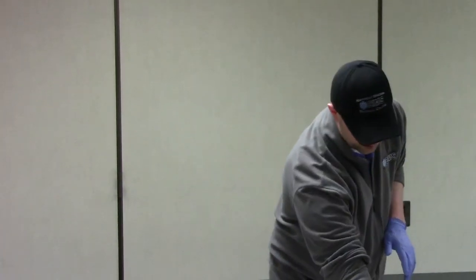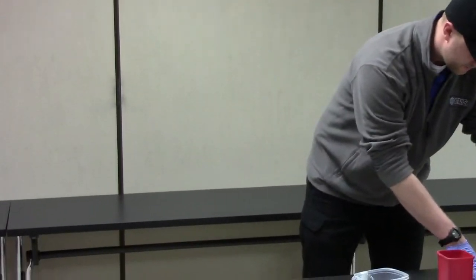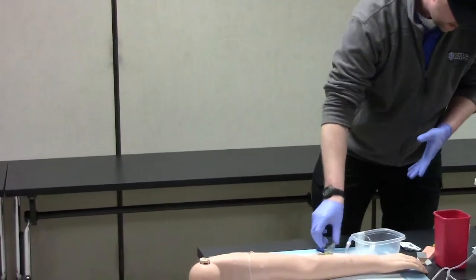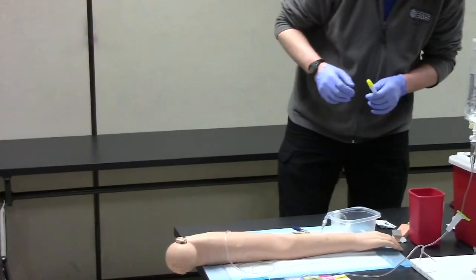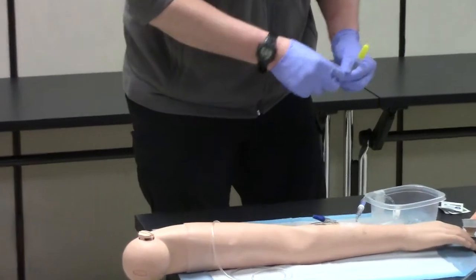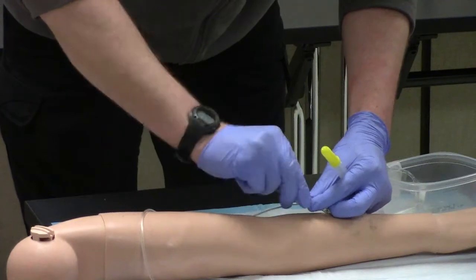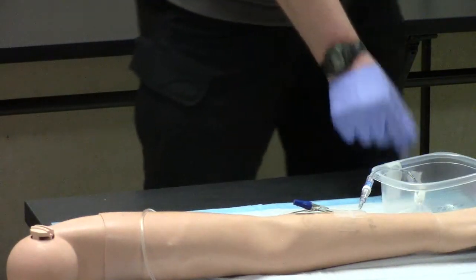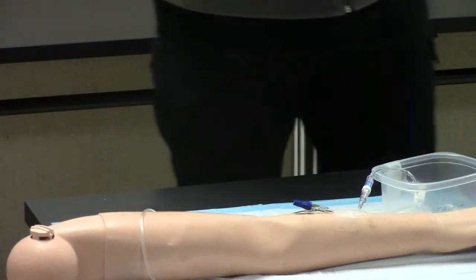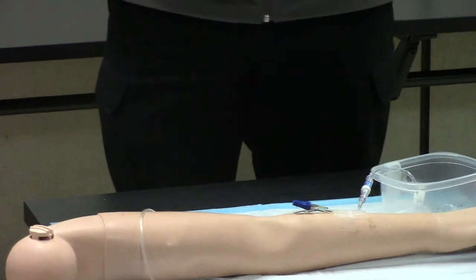We already have this line going, as if it were running into our patient, so I'm going to turn the fluid up to my TKO here. I'm going to make sure I have my BSI on. My injection site is going to be up here in the port, so I'm going to grab an alcohol prep pad and clean the medication port, and give it just a moment to dry off.